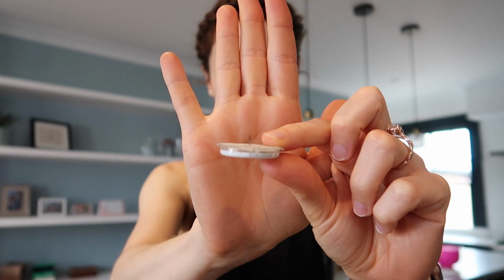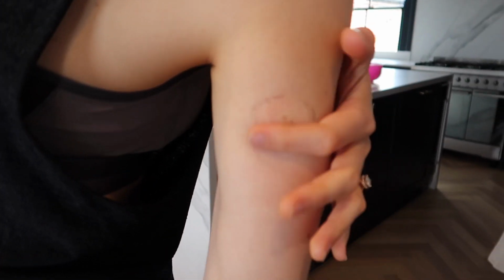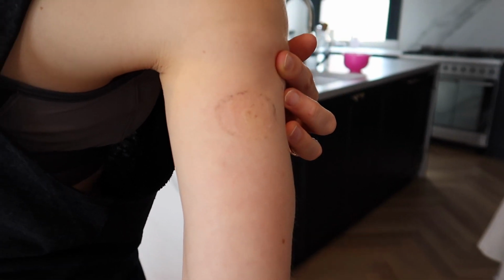Okay, it's very tacky though. The adhesive they use is very, very tacky. Also, to show you, that is what the filament looks like. That's not a needle, just so you guys know that. And that's what remains when it comes off.